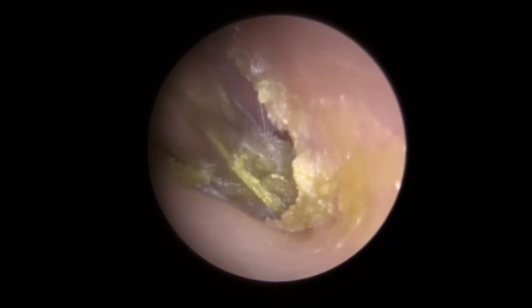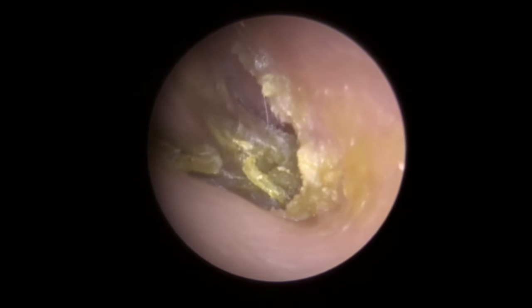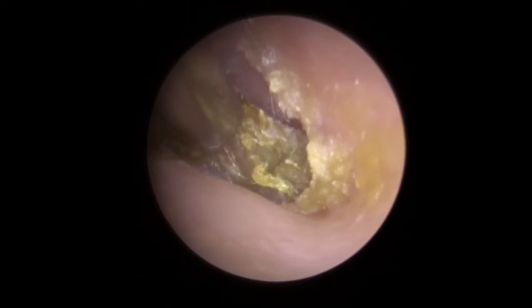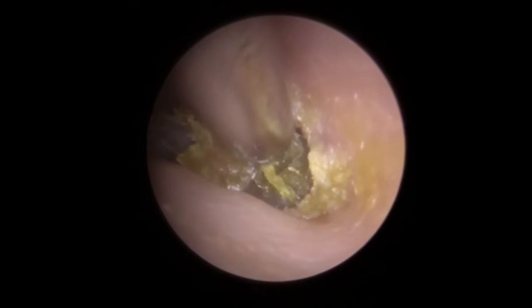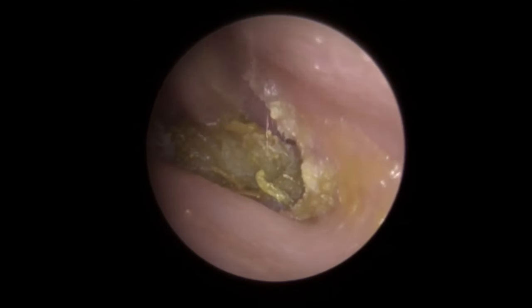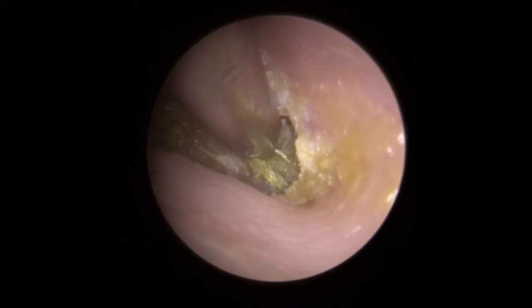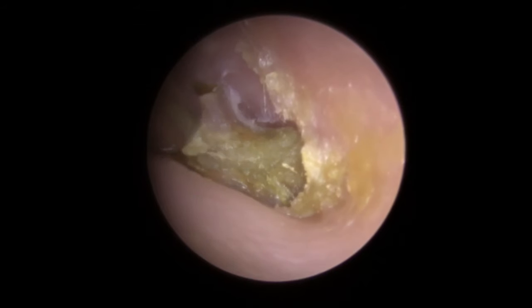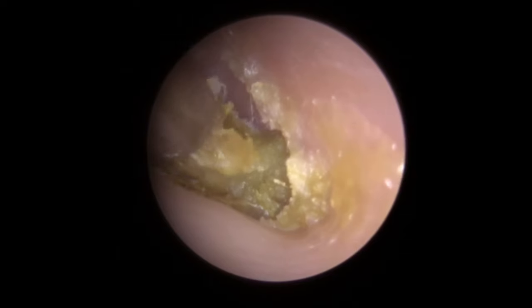The patient was an absolute star — you're always checking with your patients, but he did so well because it's not a pleasant place to have it taken away from. And you can see now it's really starting to come away — you're getting this thicker skin debris. I've slowed this down because you can see it peeling away from that main body of wax, getting sucked straight into the machine. With this type of problem, it's always breaking it down layer by layer. We've got to be so careful because this is quite firmly attached to the canal walls.